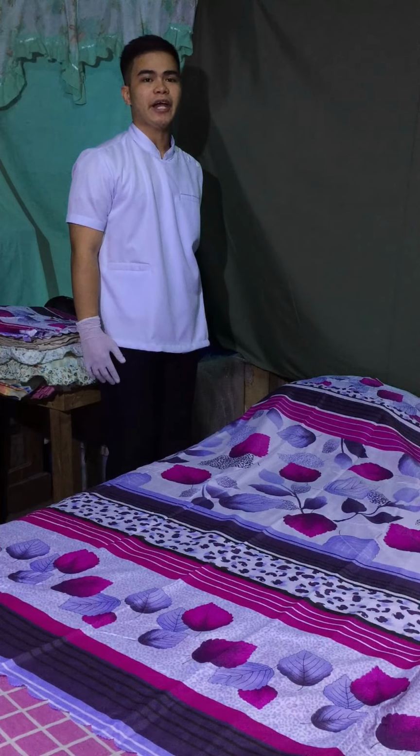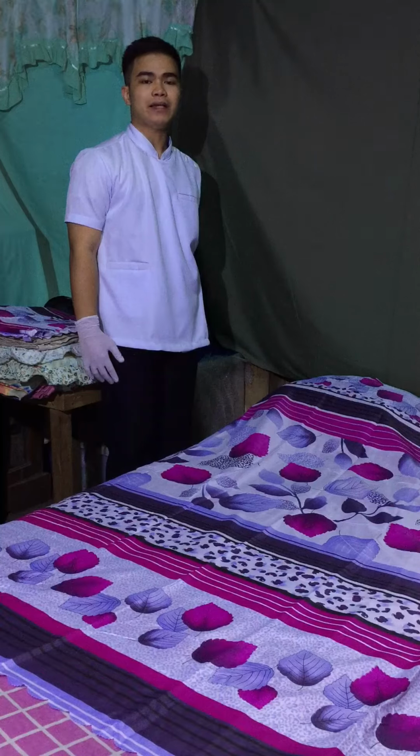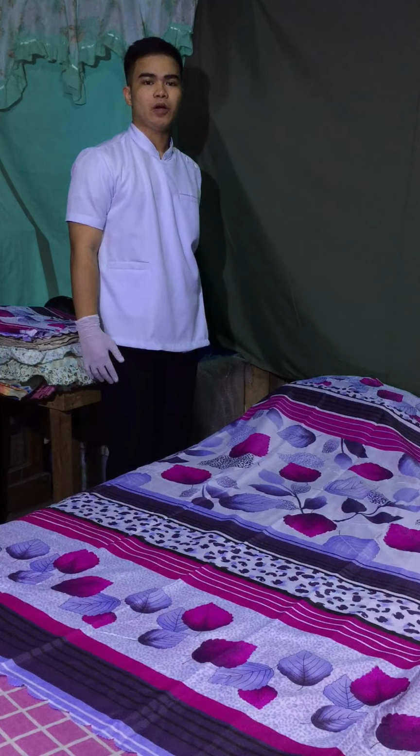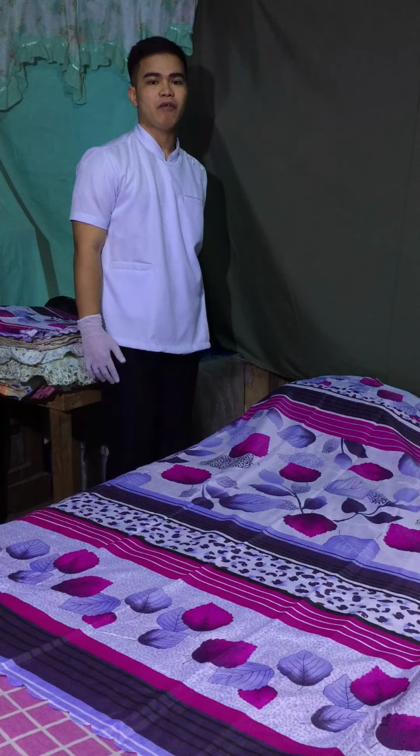Then, place a chair at the foot of the bed and lock the bed. Remove pillowcases and place pillows on a chair or at the bedside table. So, securing the bed is important to avoid injury.